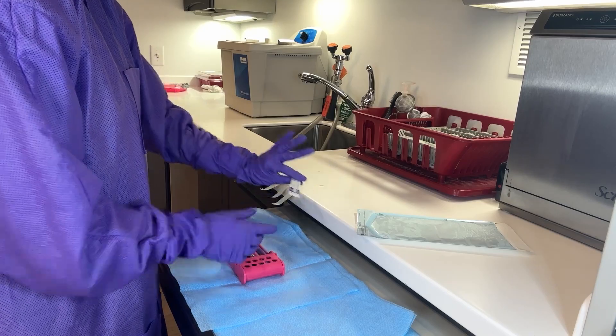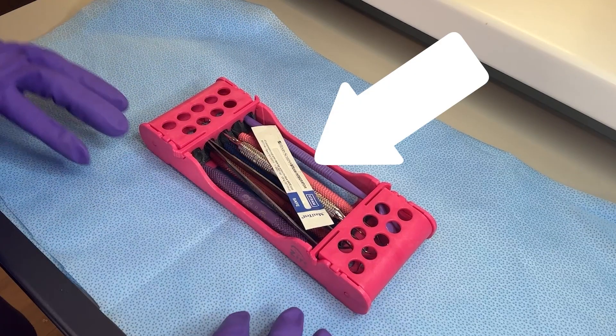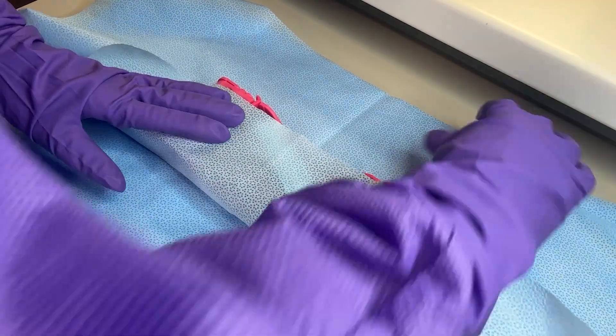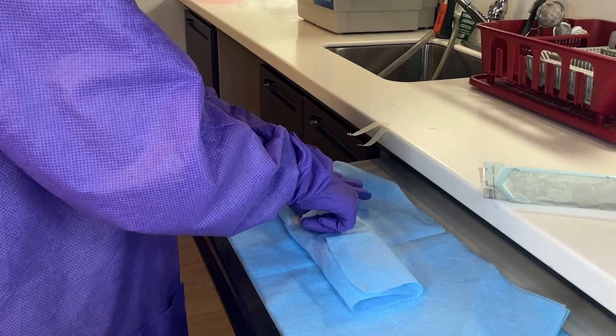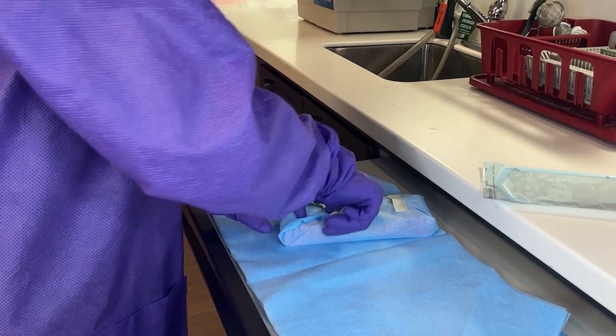An essential component of the packaging process is the use of chemical indicators. For packs that are wrapped, indicators are placed inside the packaging and on the outside of the package. These will change colors when exposed to specific sterilization conditions.